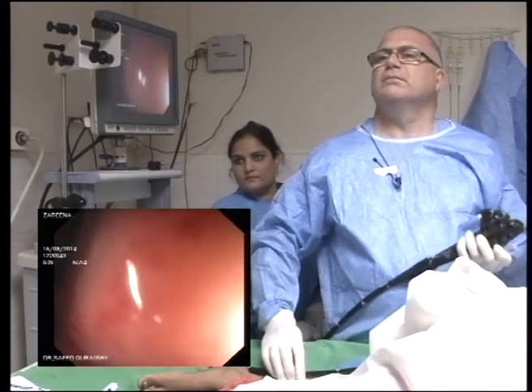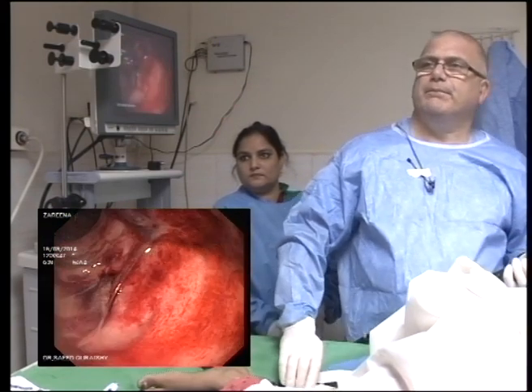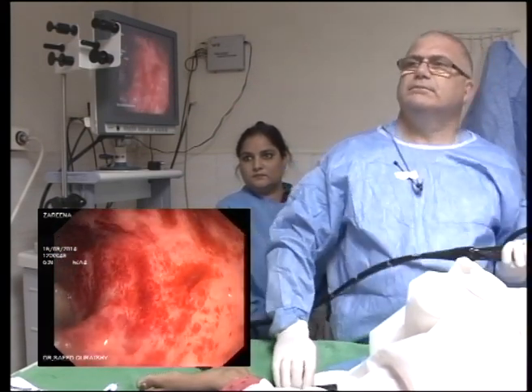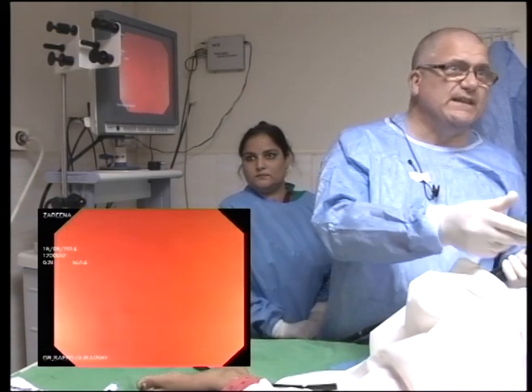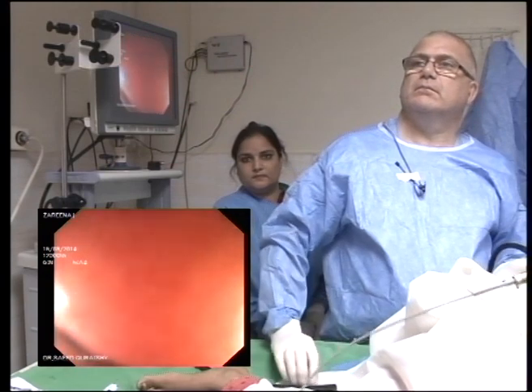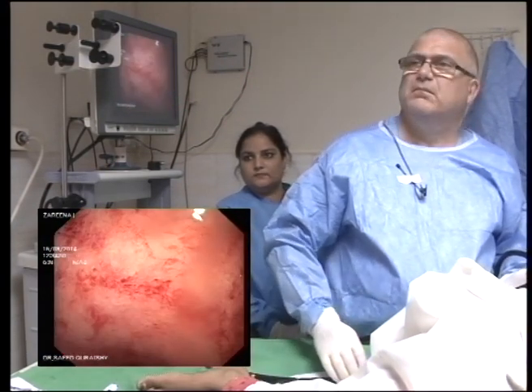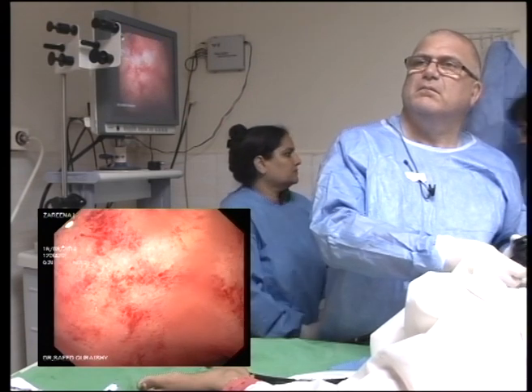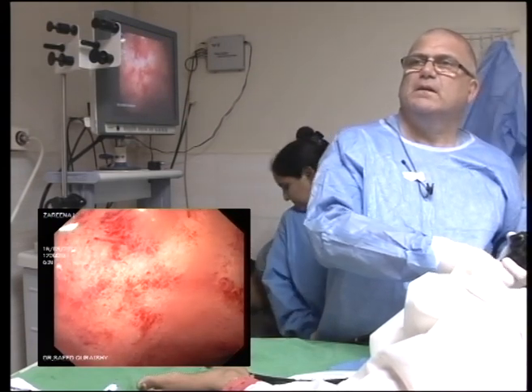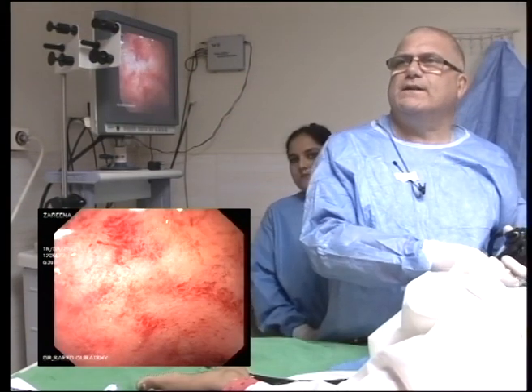I think this is exactly what we discussed in the beginning, indication, contraindication. This would have been a contraindication to a colonoscopy. Number one, it was an acute abdomen. Number two, it was a toxic dilatation, which I listed as a contraindication. And number three, if it's acute severe colitis like this. Ideally, they should have given more information about this patient. So what I'm going to do now is just do a slow demonstration.